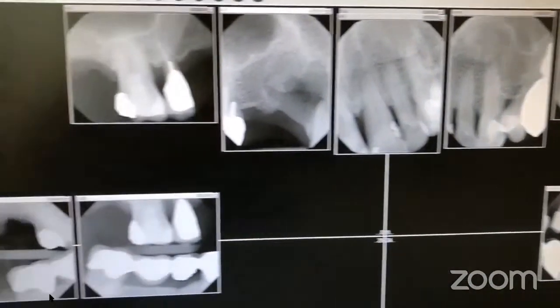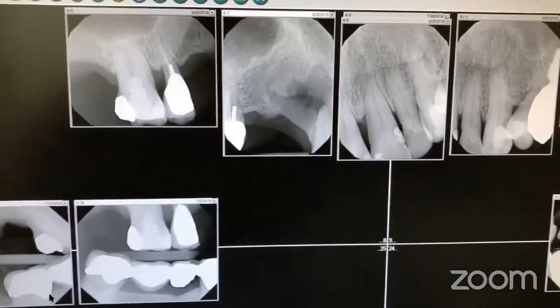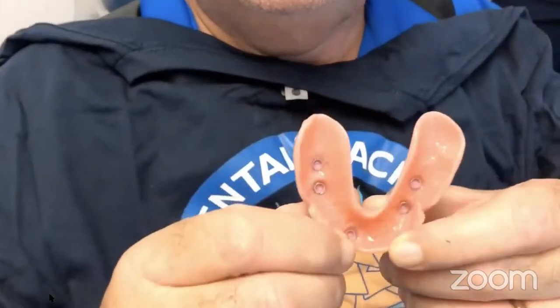So we decided different plans, talked with him on many of our treatment plans and options, and we went with an implant overdenture. And today we have a U-shaped implant overdenture. We're going to take a look at this here. So Bob, bite down and smile for us. Awesome, look awesome. Now pop them out for us to show us how they work. Good, so they snap into position there. They're the snaps inside of here. I'll just take a look there. They're the snaps there. And our mentee, our baby age dentist, Dr. An, did an awesome job.